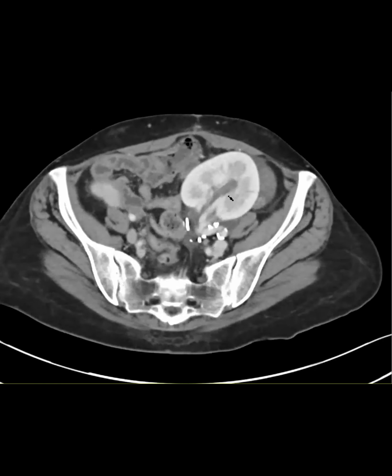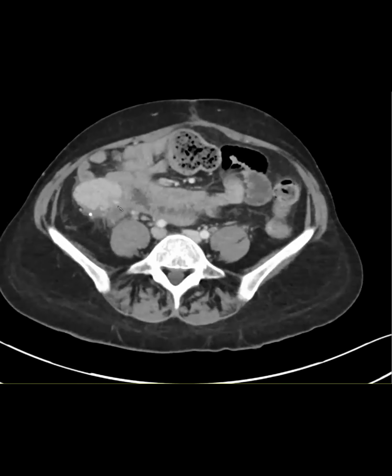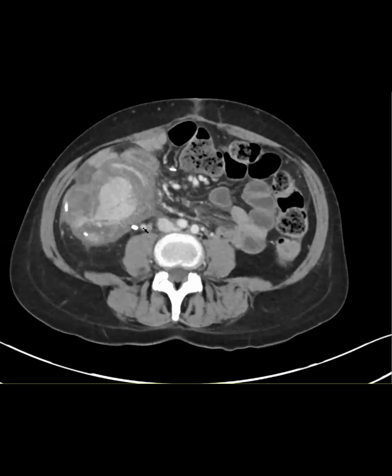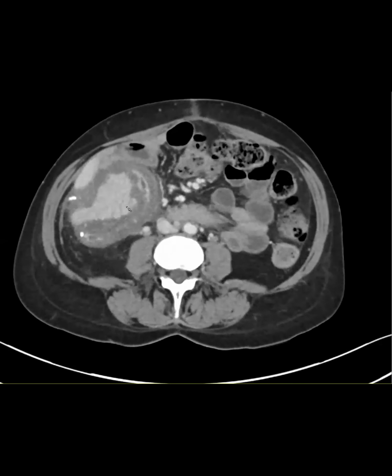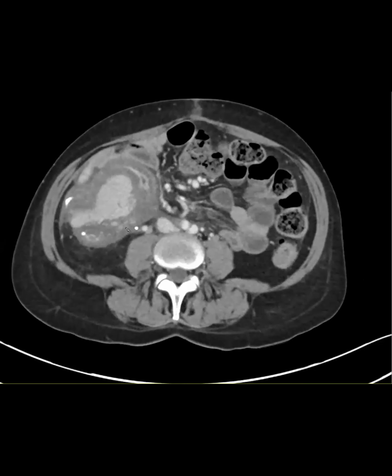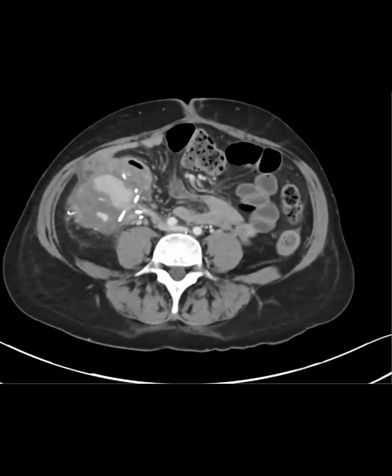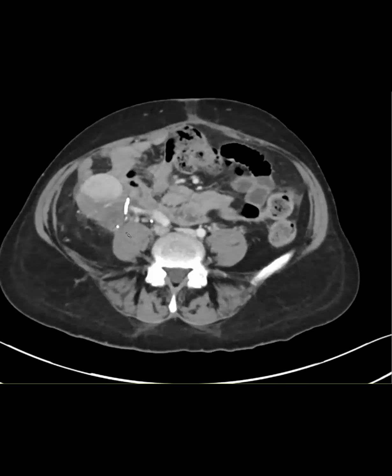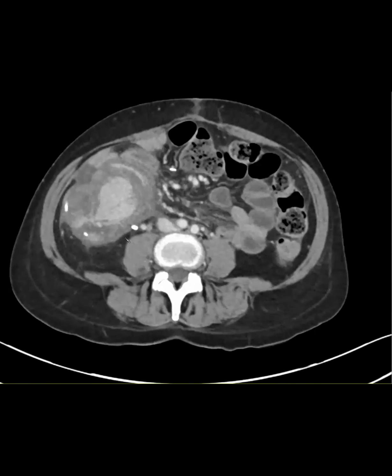Okay, so we have a renal transplant on the left, and we've got this process on the right. Like a pancreas transplant? Yeah, good. So this is a pancreas transplant, and then what else is going on with that? There's peripancreatic heterogeneous fluid, so hematoma. I don't know if I saw some extravasation lower down. Or is it pancreatitis in the... True.